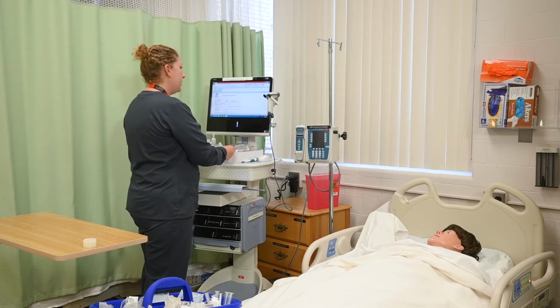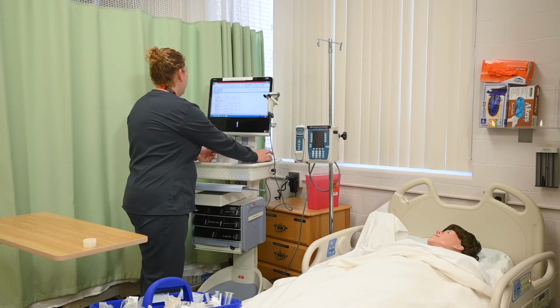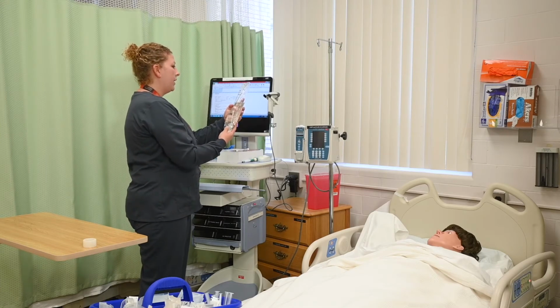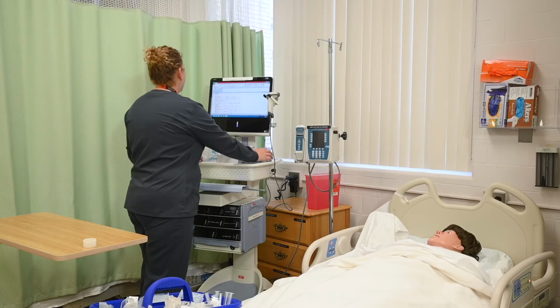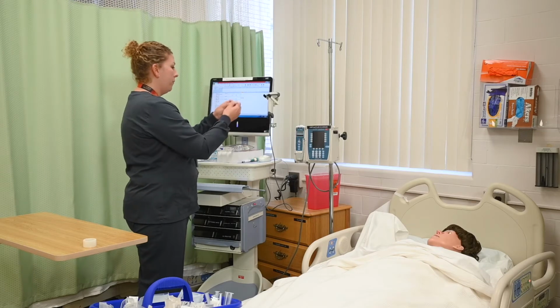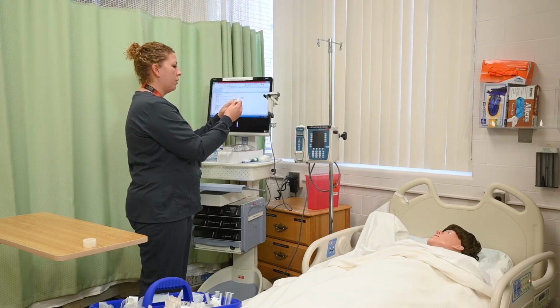I have IV practice, date of birth 3/3/87. 0.9 sodium chloride, 100 mLs per hour, IV. I have 0.9 sodium chloride IV fluid. IV practice, date of birth 3/3/87. 3 to 10 mLs, 0.9 sodium chloride IV PRN flush. I have 0.9 sodium chloride flush.